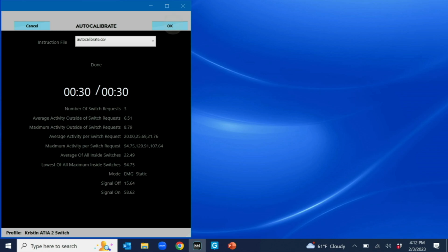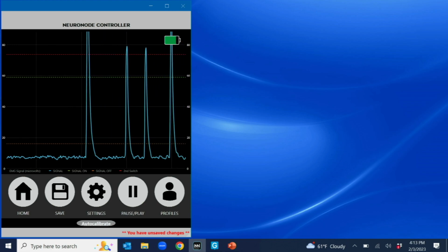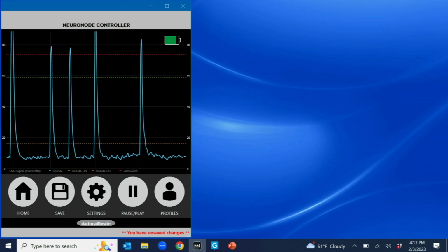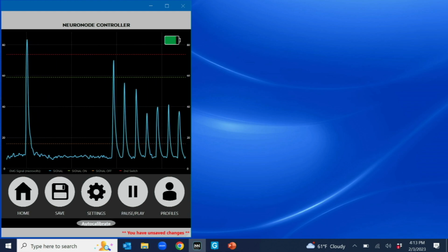So we'll go out here, and what we should see is that our lines are in significantly different places than they were before. And so now it's set based on what she did. So I'm going to have you make that same movement. And it's now clearly going up above this on and then back below this off. So the off is the amber line. The on is the green. And that red line up there, that's just my second switch line that I had up there from before.